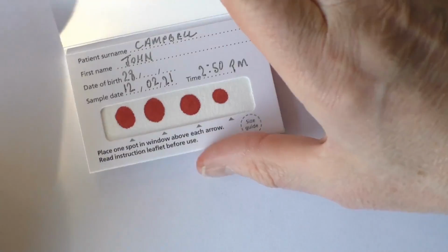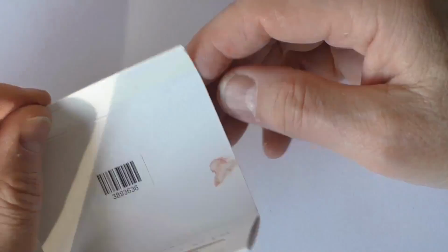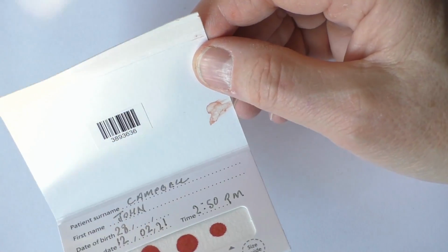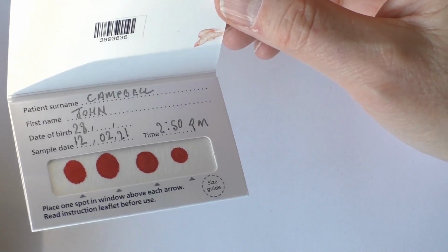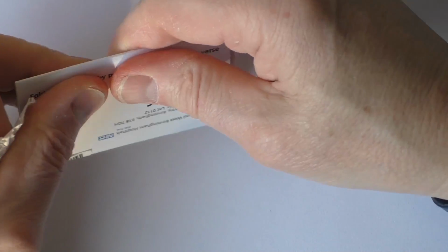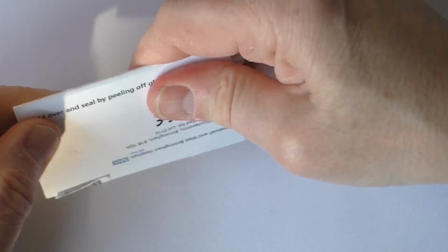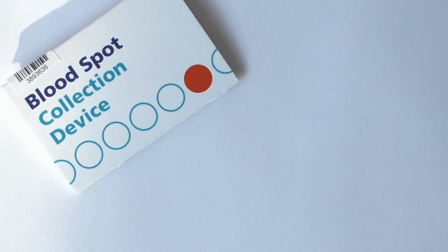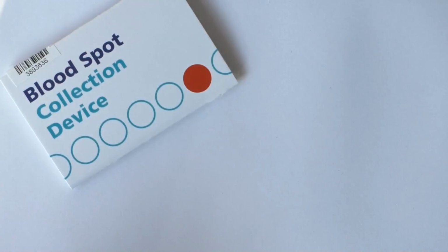And then all you do is just close that up. There should be a sticky strip there, yep. Take that off. Fold that over and stick it down. And there we have it. We don't know what it is straight away, so it goes in the bag and we send it off with the consent form. And please don't worry, I did remember to put my date of birth on before I sent that off. It just slipped my mind before. So when those results come out, you're going to be the first to know.